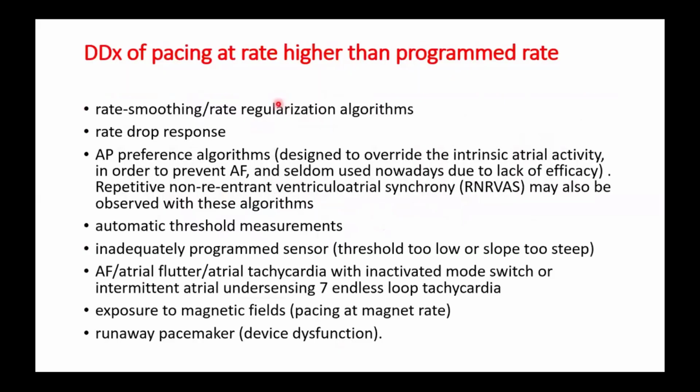And this is the differential diagnosis of pacing at a higher rate than the programmed rate. You should always think of all of these. First, the rate smoothing and rate regularizing algorithm, and this feature is programmable. Second, rate drop response, which is programmed in Medtronic devices for cardioinhibitory syncope.